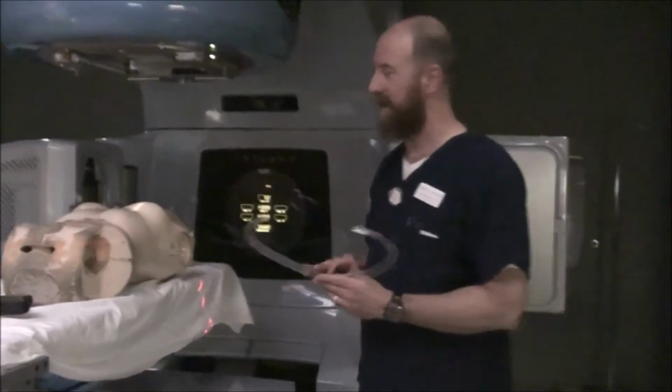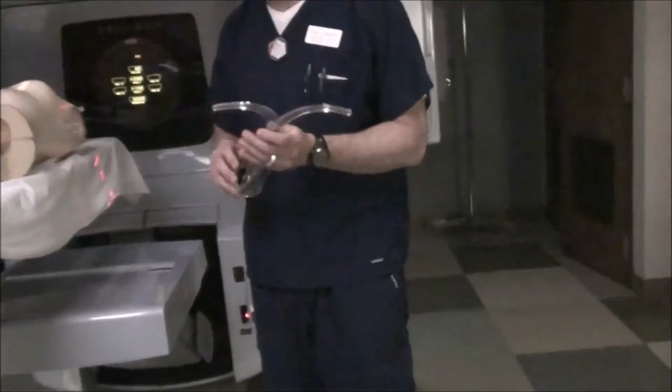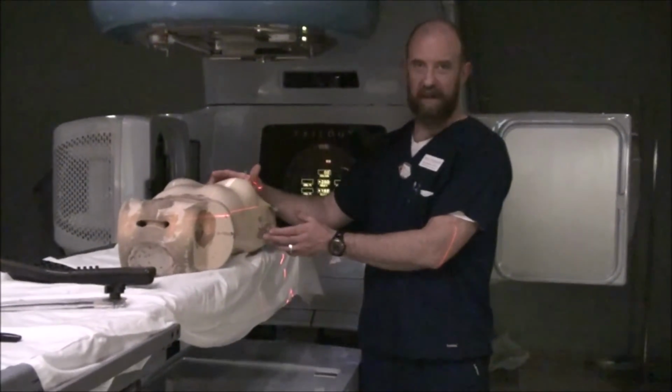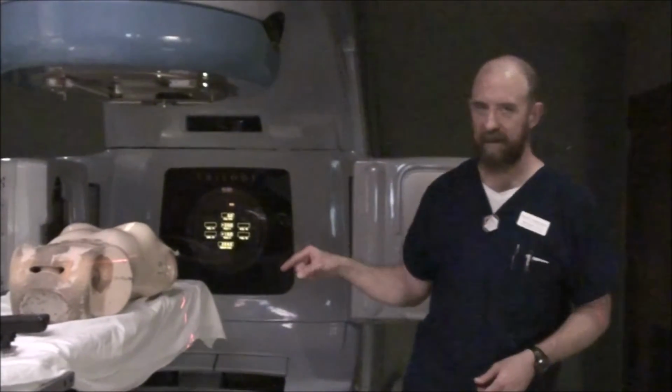I apologize so much for forgetting that. It just makes it faster. It doesn't make it wrong. Well, I mean, you'll get to the same place by watching where your wires cross and all that. I just like doing things in the right order. So, but anyway, that's where you take your separation, entry and exit points, measure that distance, divide in two, minus 100, you're going to get your SSD.